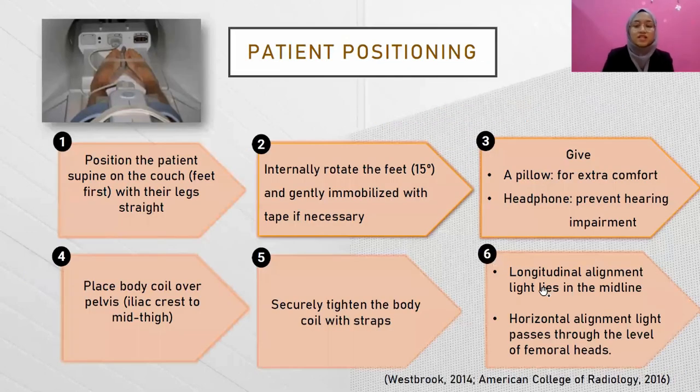Next is patient positioning. First, position the patient supine on the couch, feet first with their legs straight, and then internally rotate the feet 15 degrees and gently immobilize with tape if necessary. It is similar to this image.